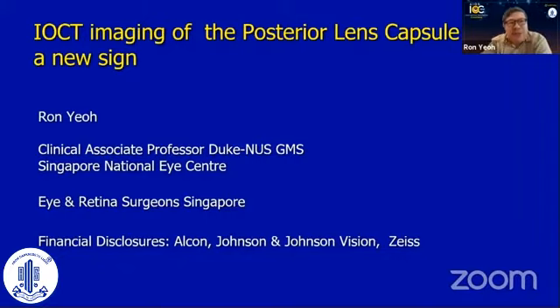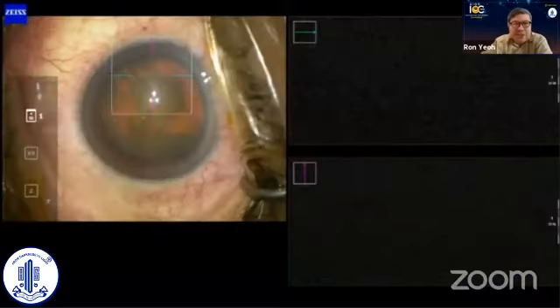Well, I'm going to be sharing with you my thoughts on the IOCT imaging of really mainly the lens capsule. And Namrata, I know you made a presentation on this a day or two ago, and I'm sorry I missed your talk. I hope I don't overlap with you too much. But I've been having such fun really learning about this new imaging technology during cataract surgery. So I thought I'd just share this with you.